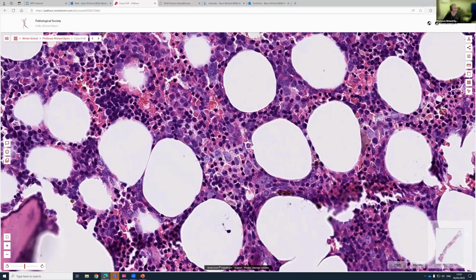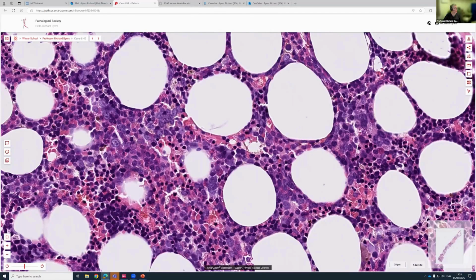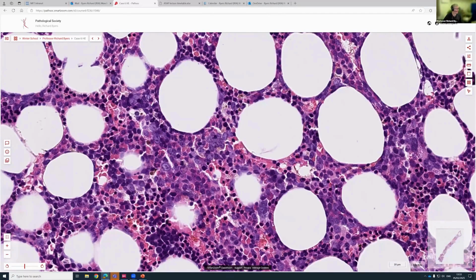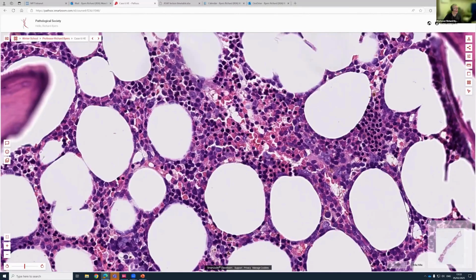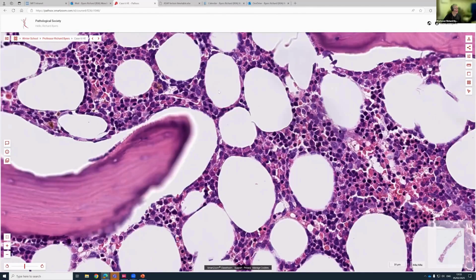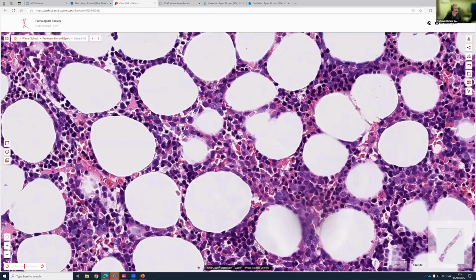These immature myeloid cells should be down near the trabeculae. Once they wander off into the middle of the marrow, then they're abnormally localized. That's an immature feature. The erythroid cells are a bit disrupted. So we've got an erythroid island here, but the small, round, dark erythroid cells are also scattered in places on their own. And then the megakaryocytic lineage, you get micromegakaryocytes, and that might be a micromegakaryocyte there.